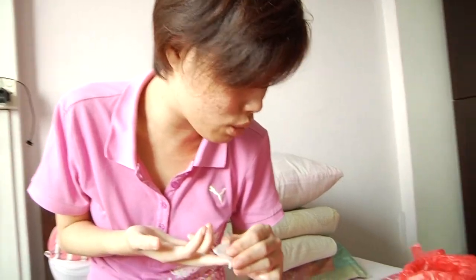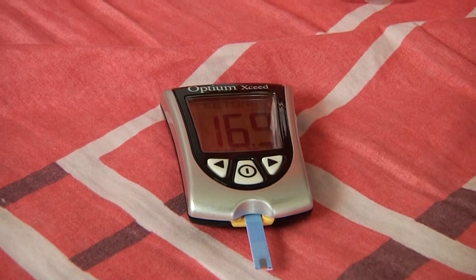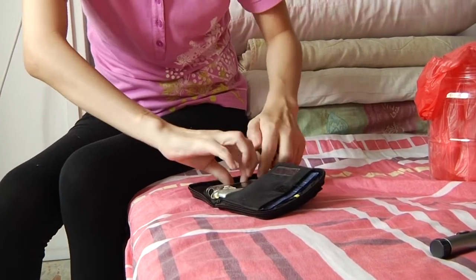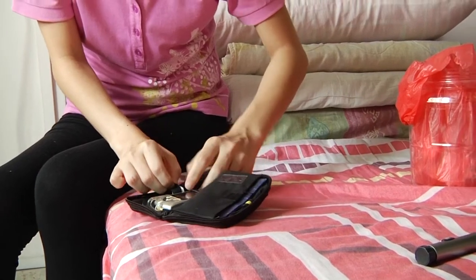How many? Sorry, I couldn't see. This one cannot talk. 16.9. Morning 14.2, now 16.9. So now I take 15. Okay. Take this. Sorry.